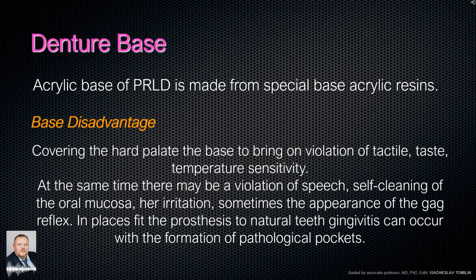Base disadvantage. Covering the hard palate, the base may bring on violation of tactile, taste and temperature sensitivity. At the same time there may be a violation of speech, self-cleaning of the oral mucosa, its irritation, sometimes the appearance of the gag reflex. In places where the prosthesis fits to natural teeth, gingivitis can occur with the formation of pathological pockets.